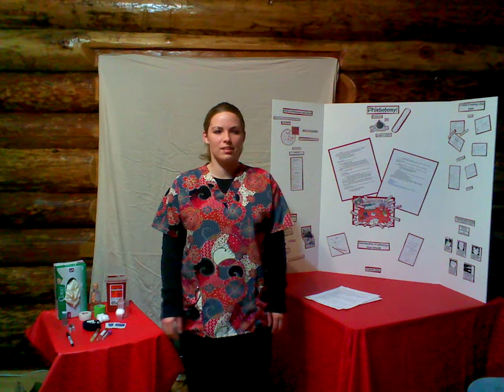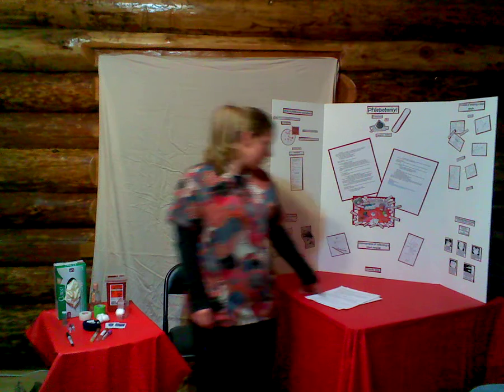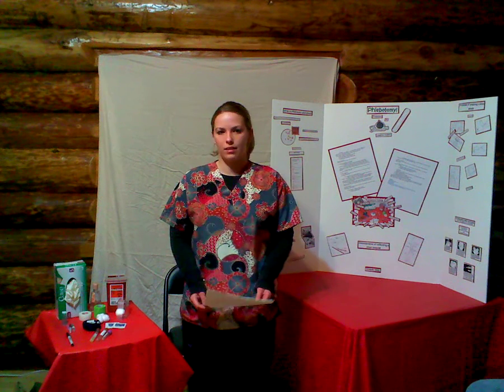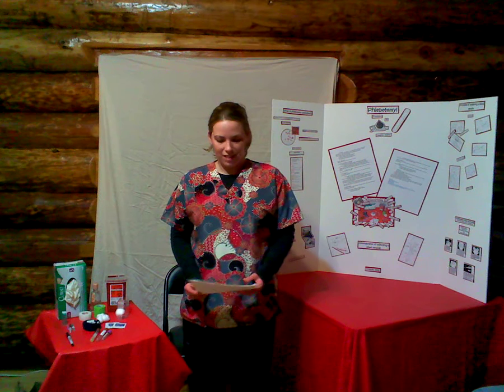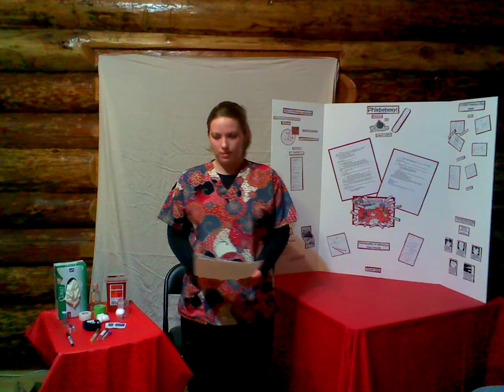I'm Heather, a part-time phlebotomist, and I will be talking to you today about phlebotomy. There are 3 key points I'd like to inform you on today. Then I'll demonstrate how to collect the blood sample. Now let's learn about phlebotomy and blood.